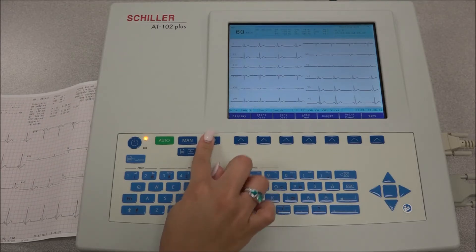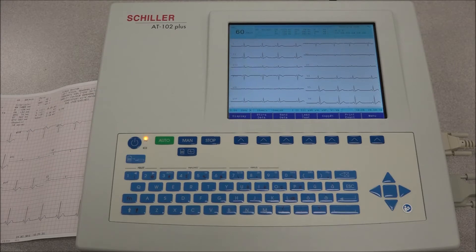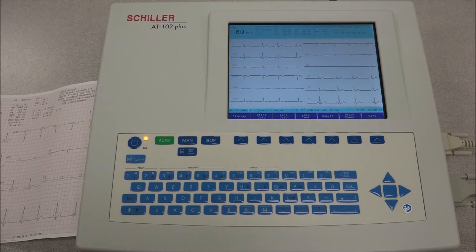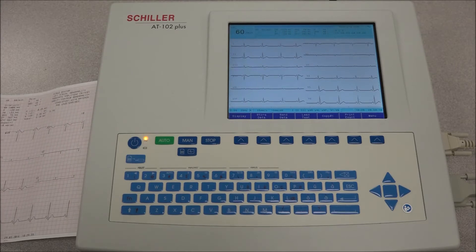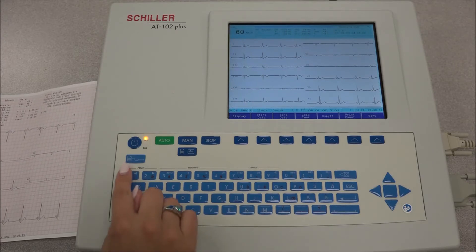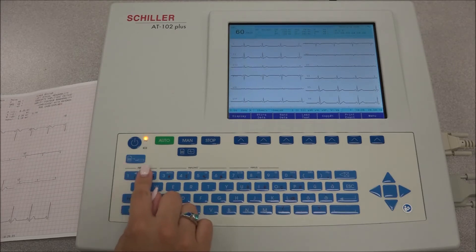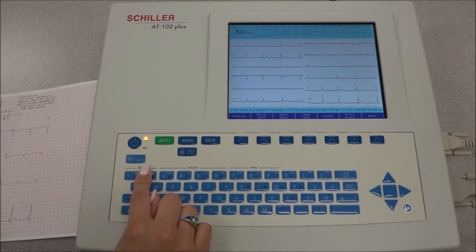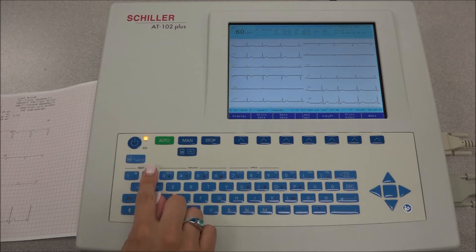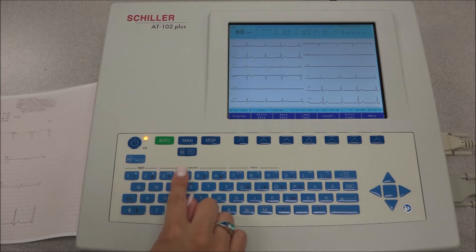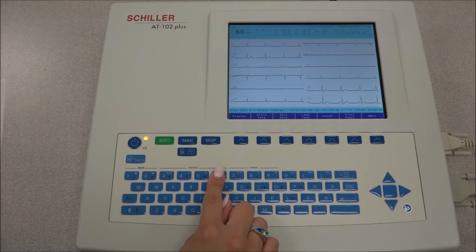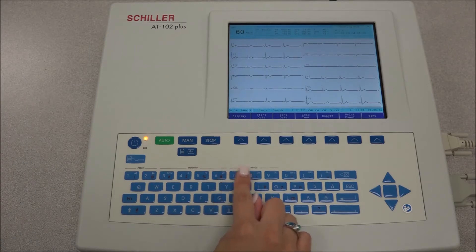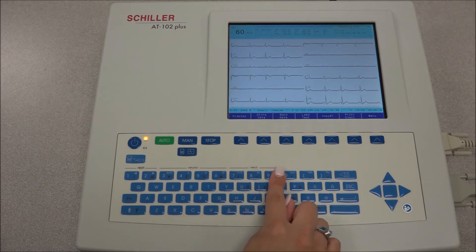In order to change the printout lead group, speed, and amplitude, the following keys are used. To change the lead shown on the screen or being printed, press keys 1 and 2. Press keys 3 to 6 to adjust the amplitude, and keys 7 to 9 to adjust the speed.